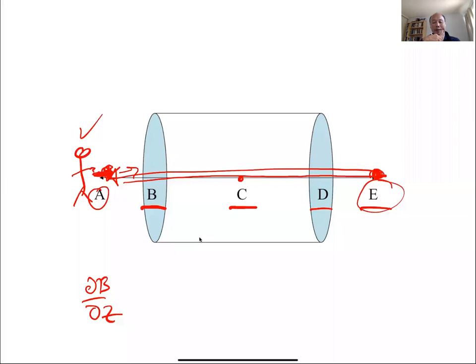And so this is a very dangerous situation to be in, and I actually know people who have almost lost a finger because of this. Even very experienced people sometimes forget, and they have something magnetic in their hands, and it will be pulled out of your hand and come back before you can even blink. So just to emphasize how dangerous these magnets are, you always need to be careful when you're around an MRI system.